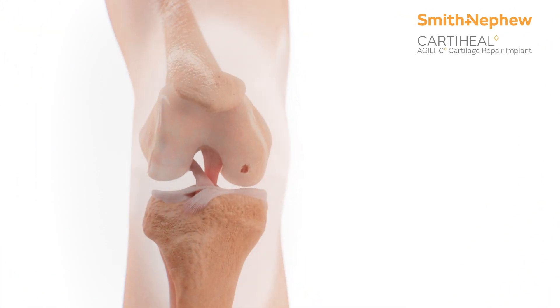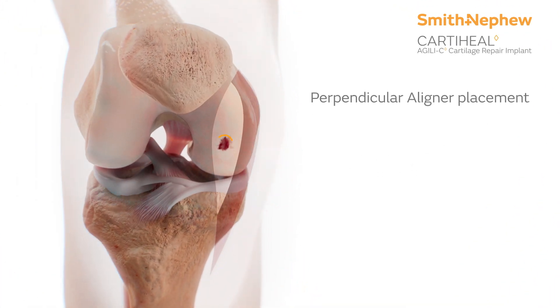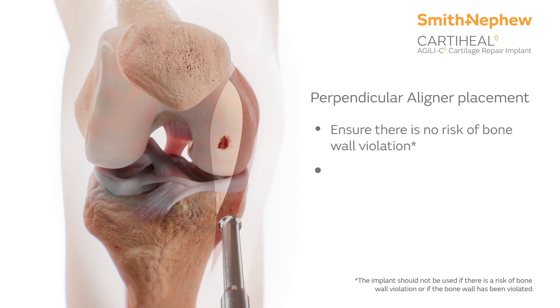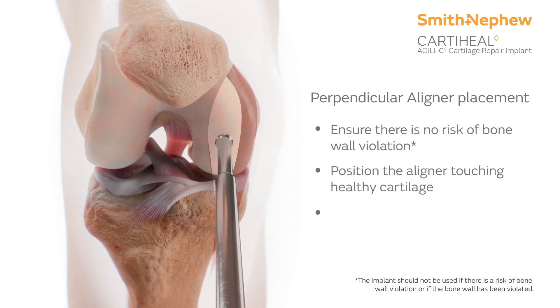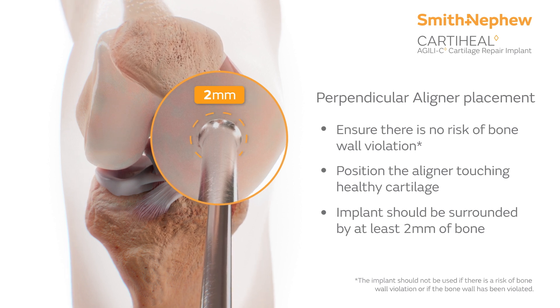Begin the procedure by making a small incision to expose the articular surface. Then, position the perpendicular aligner in the lesion and verify that it is perpendicular to the articular surface, will be surrounded by 2 mm of bone, and is touching healthy cartilage.